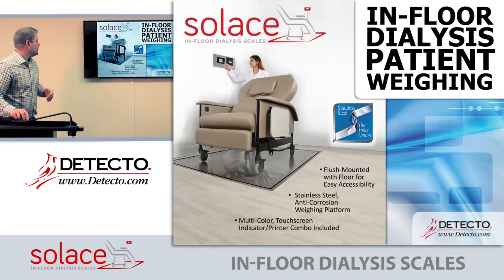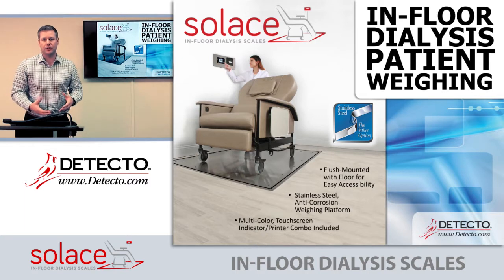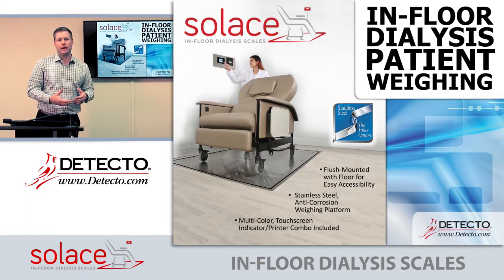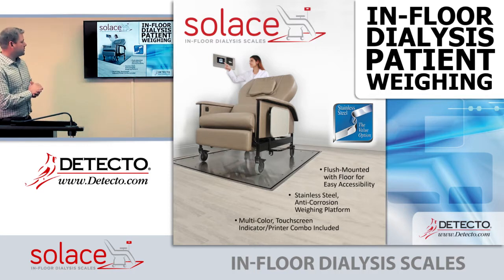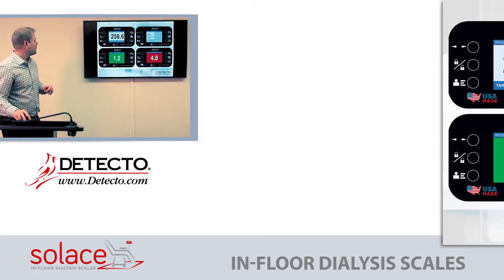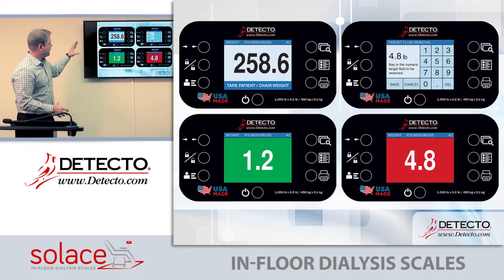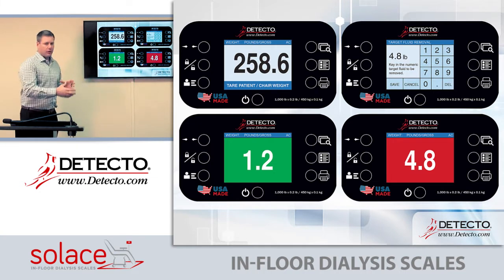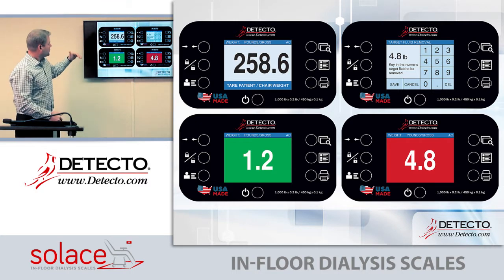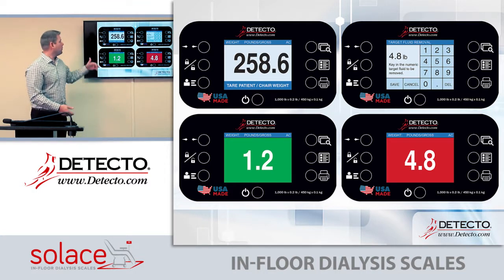Here is where we introduce our new Solus. Typically we just used our industrial range of scales in a medical application, but this is really designed specifically for dialysis. This is how the in-floor scale would be used. Here is the instrument placed in the wall. A patient will come in and sit in a dialysis chair — the chair is on the scale.